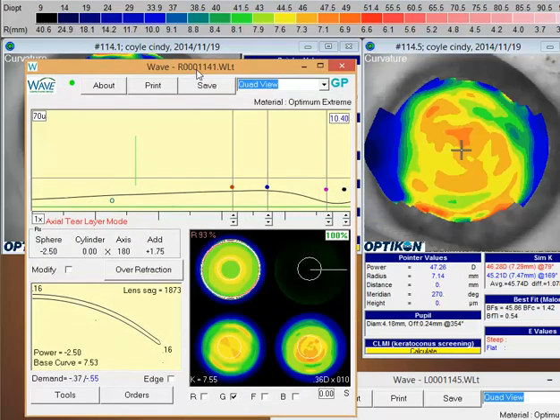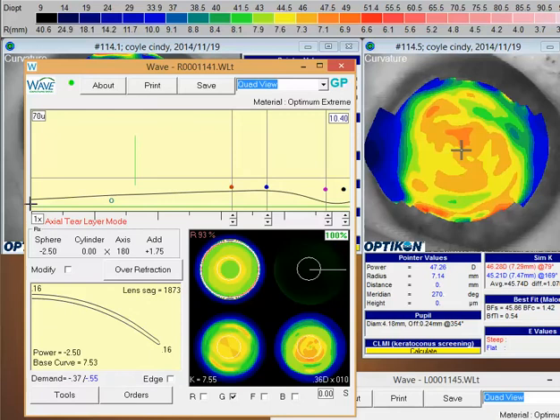With that said, if we look at your design, this is the center of the cornea over to the left, and that green line represents the corneal surface, and the black line, of course, is your lens back surface. If you look here, you'll notice you have a lens a little steeper through here, and it comes down, and it lands down out here. So we refer to these as kind of downturners, because they kind of come in at an angle down here. You've got a lens that's pretty tight at the very end here and much looser in through here. And if you look around through here, it downturns at about 2 o'clock. Vertically, we get a little downturning here. So when I look at this, my first thought is this lens is going to fit pretty tight on the eye.